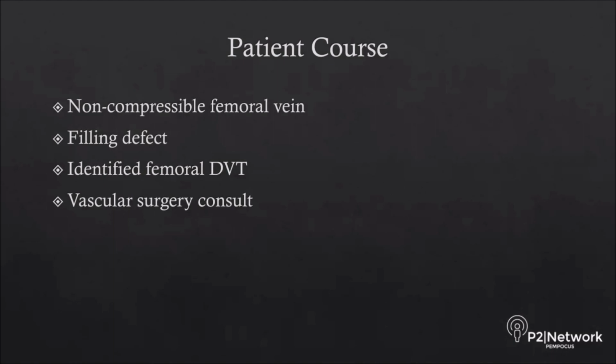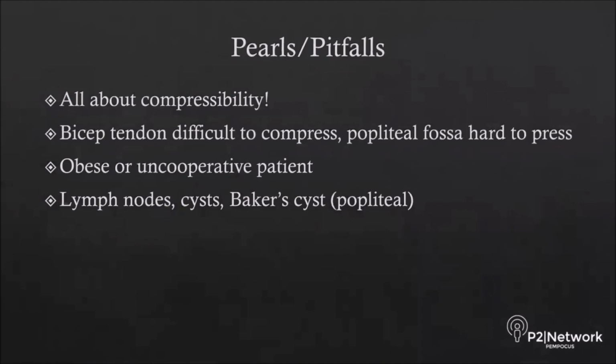This identifies a non-compressible femoral vein, indicating that there is a femoral DVT. This is also associated with the filling defect that you see here. The next step would be a vascular surgery consult or initiating treatment as needed.